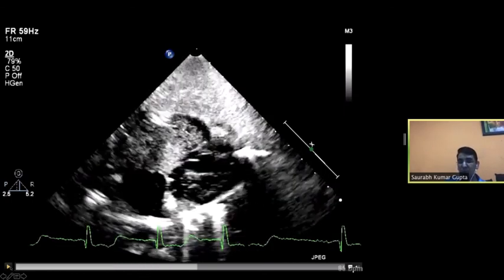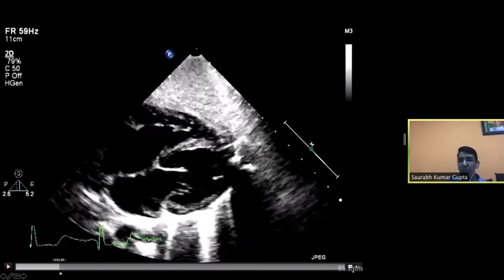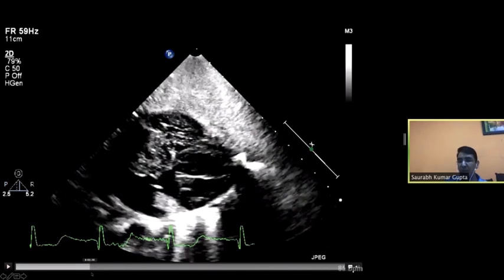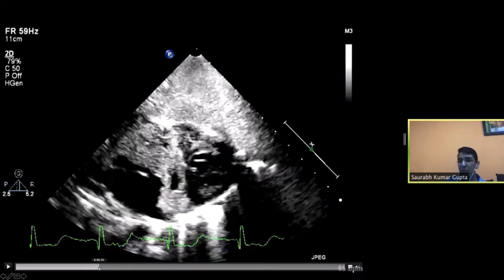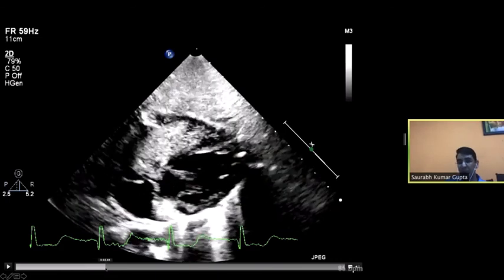So what you do is you freeze it and go frame by frame, and you will know when and what is happening inside the heart, what course these bubbles are taking. So as of now, this is the coronary sinus. Everything looks good. The contrast appears into the right atrium, into the right ventricle, and you are almost ready to say, oh, everything is fine. Why the hell are you bothering me?